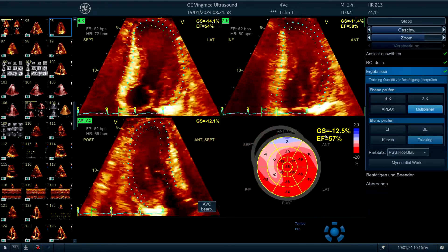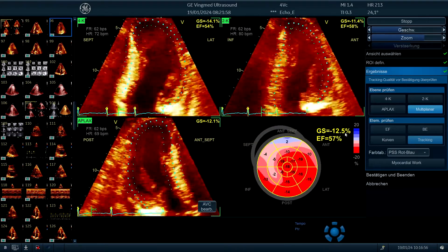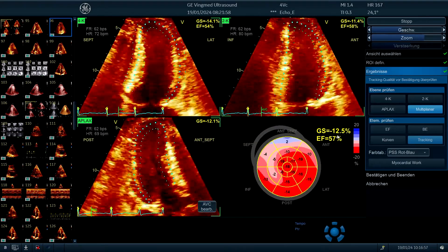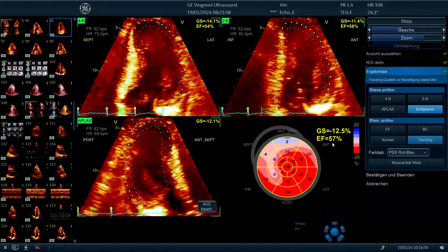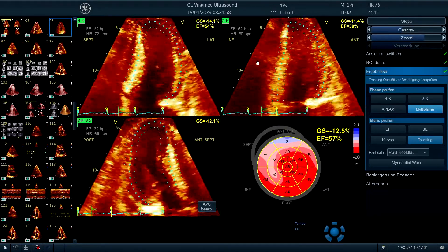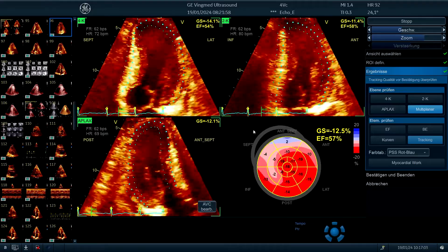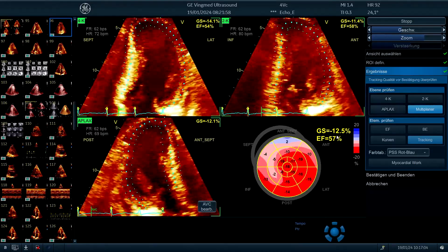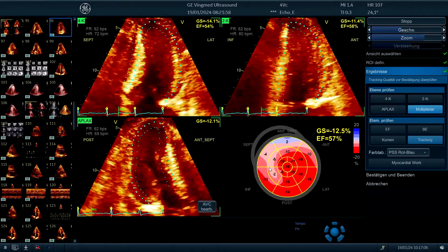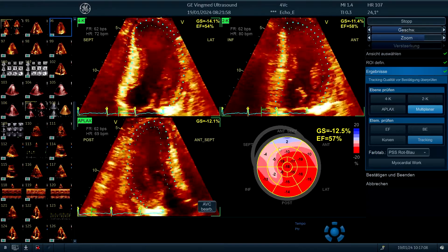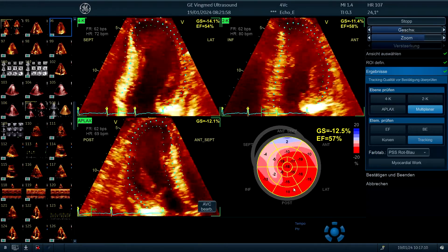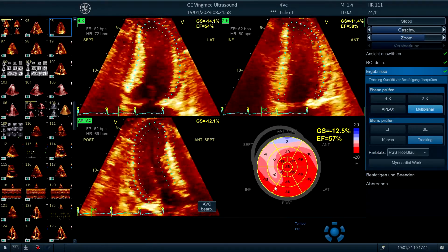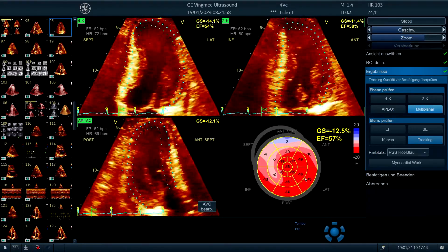Let's see what we got. We got an overall strain of minus 12.5, the overall ejection fraction around 60% is also what I think. The measurement looks valid. So we will go with this. We also see that the regions where the heart is thicker, they are reduced. The other regions, they are not that reduced, but still reduced.